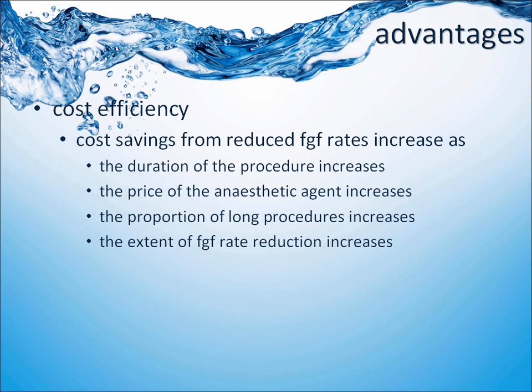The more you decrease your fresh gas flow rates, the more you would save. And you'd save more if the duration of the procedure is longer, if the price of the anesthetic agent is higher, so desflurane compared to sevoflurane. And if you do more long cases, you would tend to save more as well, because you save most of it from the maintenance part of the anesthesia.